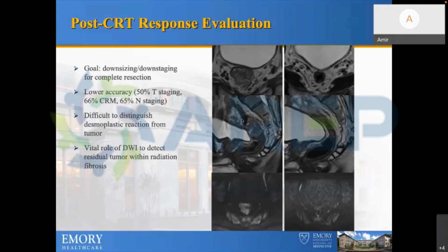Yes. To finish one study, how long does it take? Usually the time slot that we have, if it's only pelvis, is definitely below 20 or 25 minutes. That is so fast. Yeah. But if you have a liver also, it might go into 35 minutes or so. They usually start with this, they look at it, and then they do pre-contrast pelvis, and then they do the dynamic phase, the pre and post contrast of the liver, and they come back to the rectum to do a post contrast as well. So it's about 35-40 minutes.